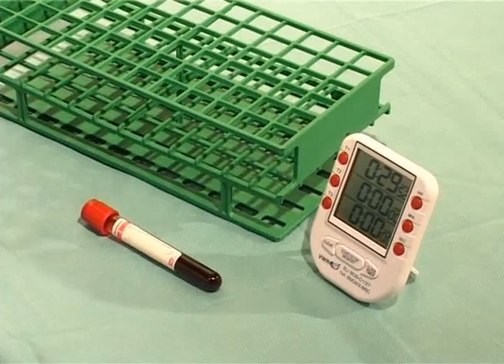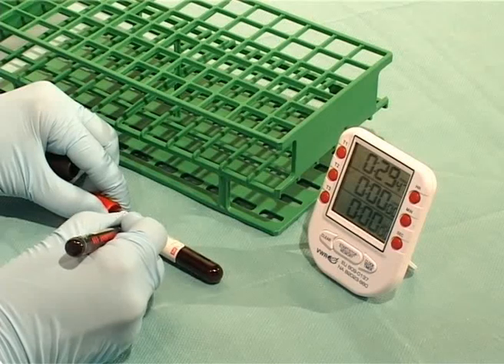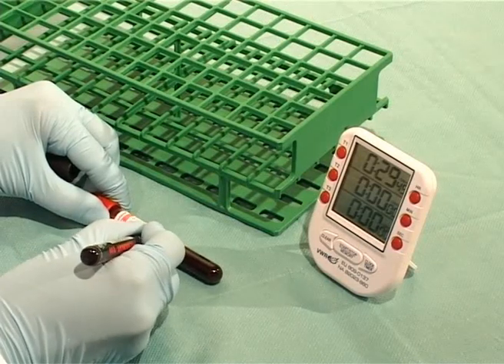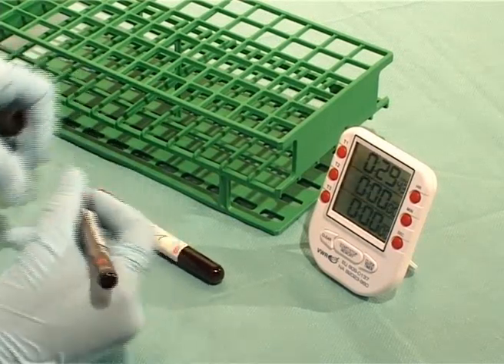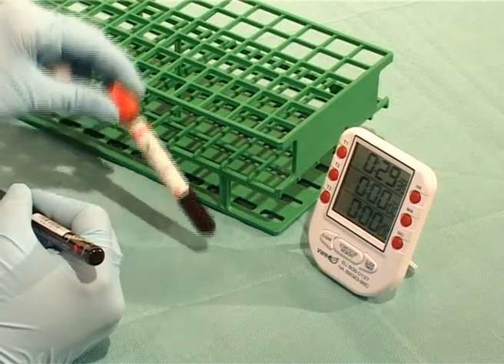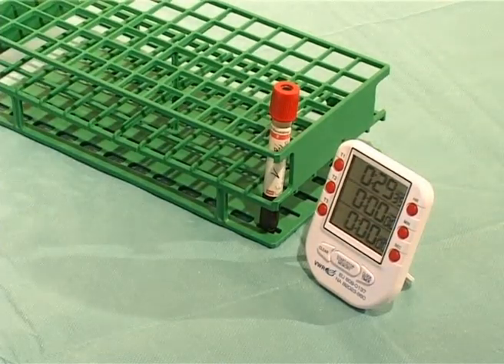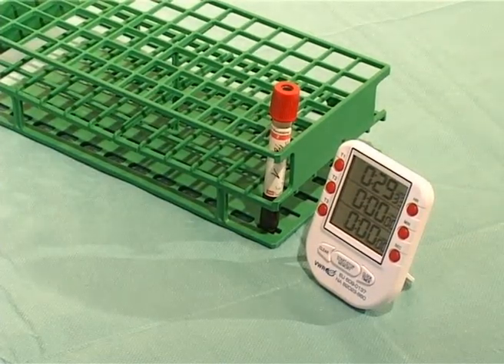The blood sample must sit for half an hour at room temperature. At this point, the sample tube must be marked so that it cannot be mistaken for another sample. This is very important. The ASST should only be performed in one patient at a time, so that accidental injections of patients with the serum of another patient are avoided.